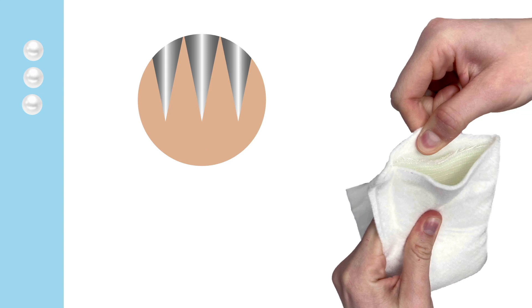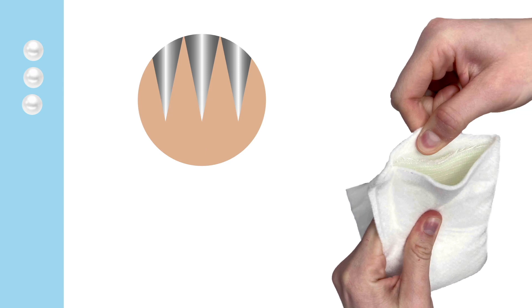The third important pearl relates to the fact that the dried fiberglass ends are sharp and will irritate or even cut your patient's skin. To avoid this, the padding should be stretched over the cut ends of the fiberglass.